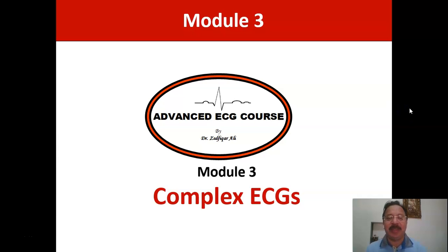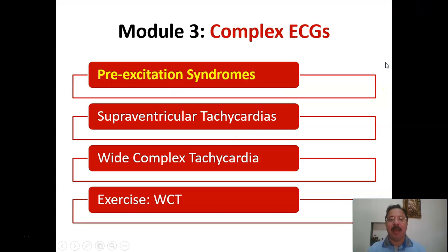Hello and welcome to module 3 of the advanced ECG course that's about complex ECGs. In this module we are going to talk about the pre-excitation syndromes, supraventricular tachycardias, ventricular tachycardias, and an exercise about wide complex tachycardia.